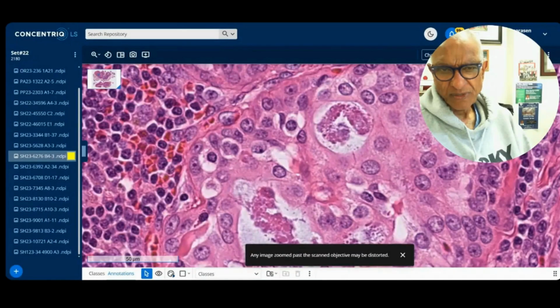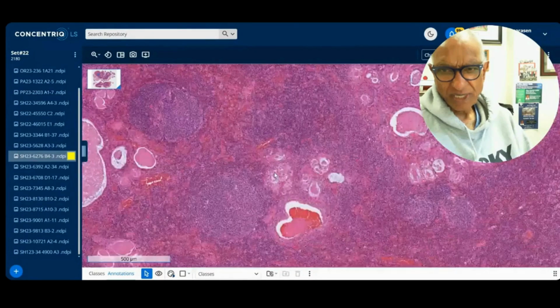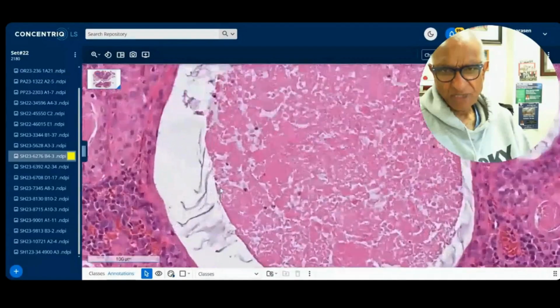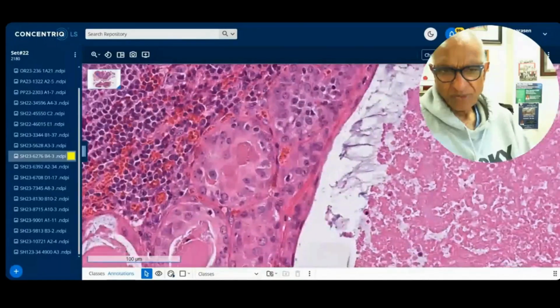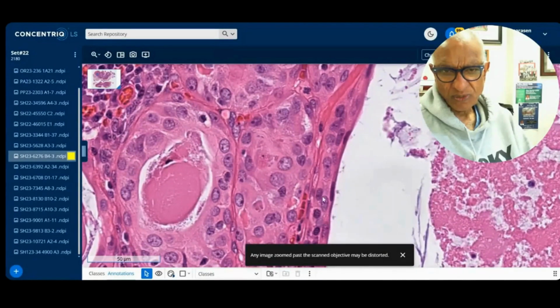Right, you can see the nuclei. Some fairly distinctive clustering of the chromatin, not too much. That's pretty much the picture. These cystic areas are the same cells, just showing you in case you feel that would be helpful. There's the cystic walls, the same cells as those, just a little more cystic.